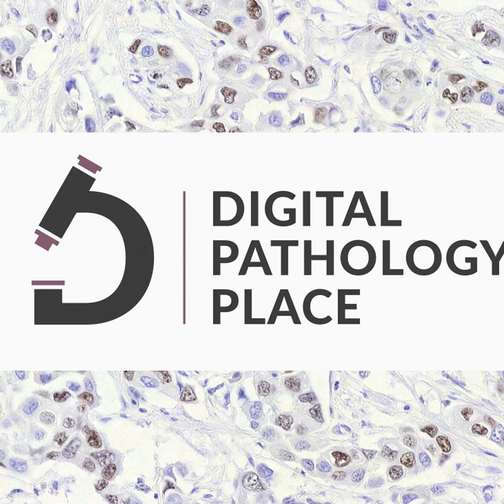Let's say the information was found in the stroma, and we have a ground truth from spatial omics in the same region, the stroma. Then we have an indication that it actually took the information necessary for the decision from the right region. Is it 100%? No, but that's as close to 100% as we can get.